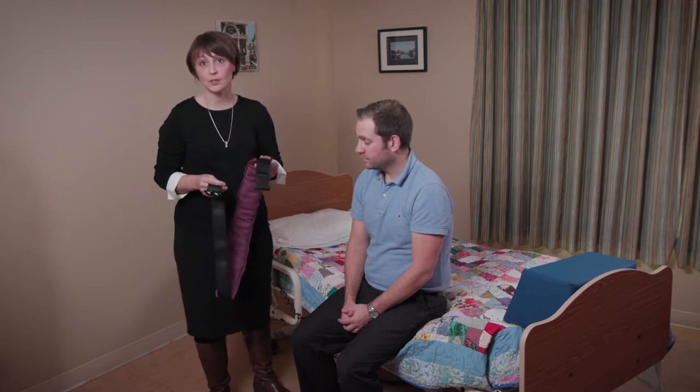Sometimes our clients may need a little support when we're guiding them for a transfer between perhaps the bed to a chair, or a chair to the wheelchair perhaps. So often the best thing to use is a transfer belt.